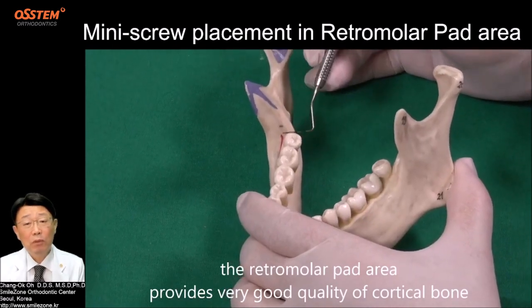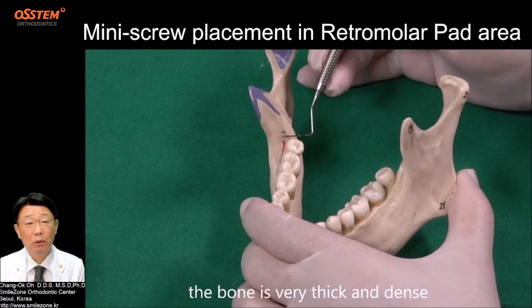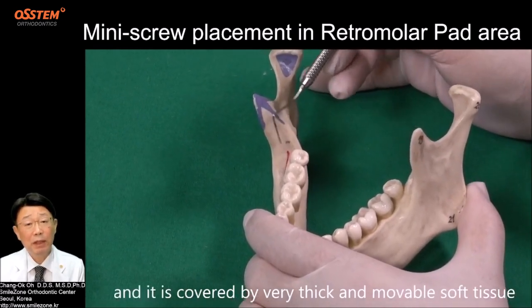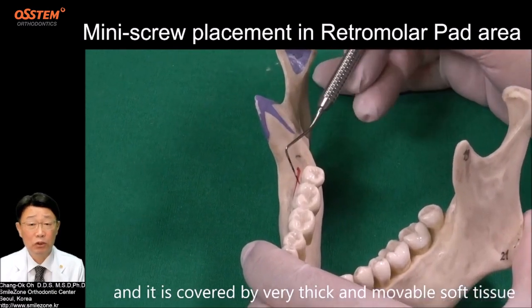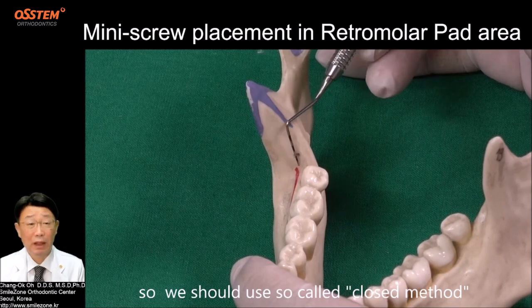The retromolar pad area provides very good quality of cortical bone. The bone is very thick and dense, and it is covered by very thick and movable soft tissue. So we should use so-called closed method.